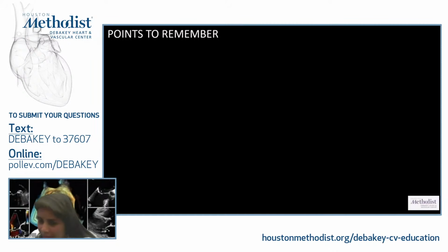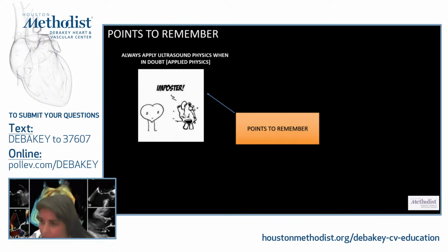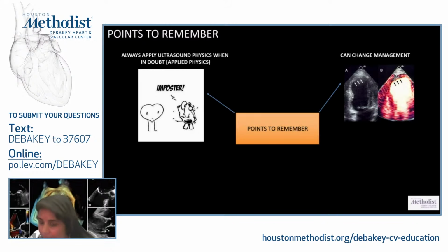Why are we talking about this? Why is it important to us? First of all, always apply ultrasound physics when in doubt and think of the basics of an artifact. Remember, it can change clinical management, and it can be very pertinent in critical decision making.